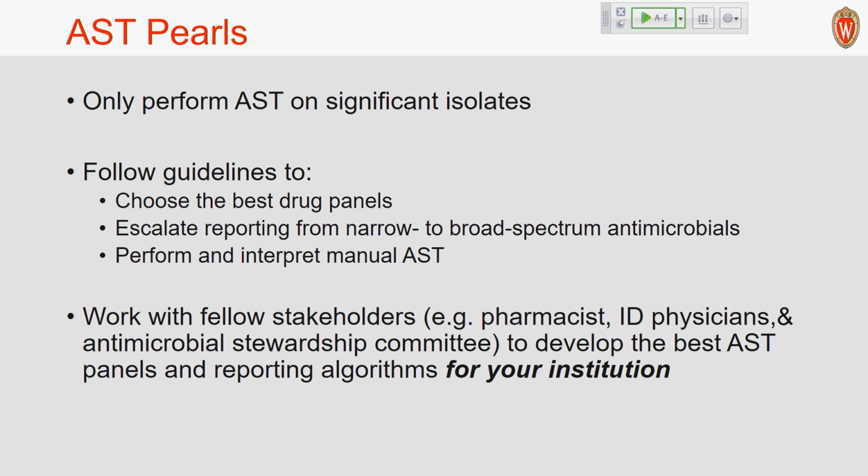You want to facilitate with the so-called cascading. So you're starting out with a narrow spectrum. So if you have an AMP-susceptible E. coli, don't report out the ceftriaxone and the cefepime.